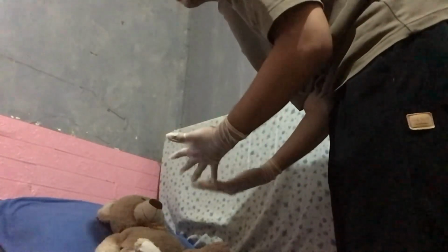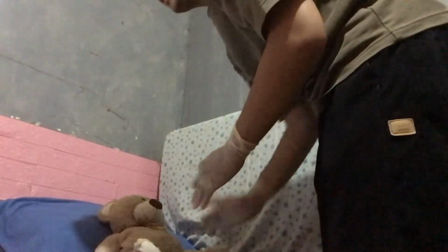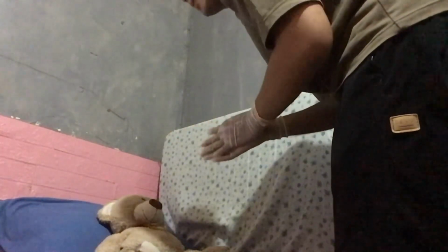Explain the procedure, inform the patient about what we will do. So we're going to insert a thin tube through your nose into your stomach to help you with your feeding or draining fluids. You'll need to sit up straight while I gently slide the tube in. You might feel some discomfort or need to swallow. Once it's in, we'll check its placement and make sure it's working properly, and it's important for your care, and we'll do our best to keep you comfortable throughout the procedure.